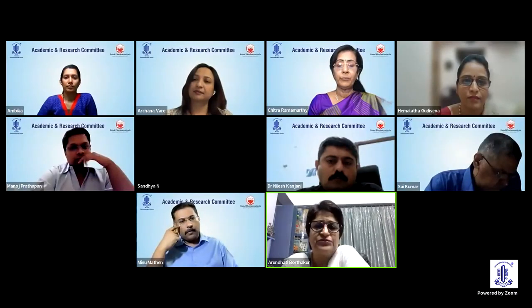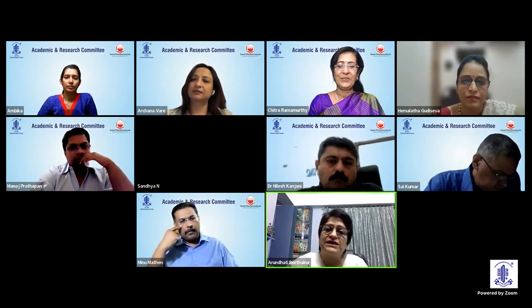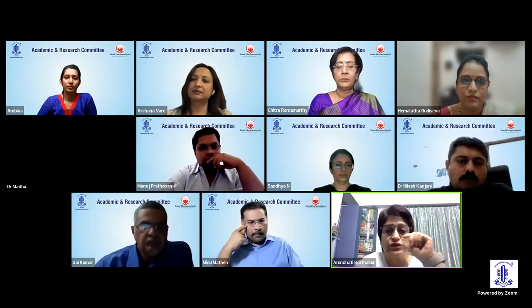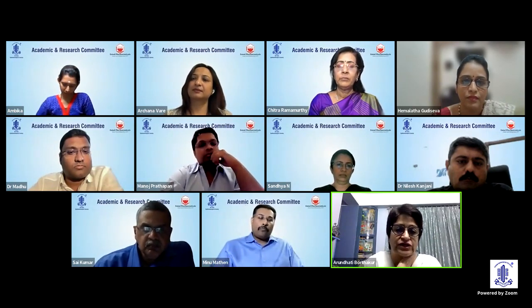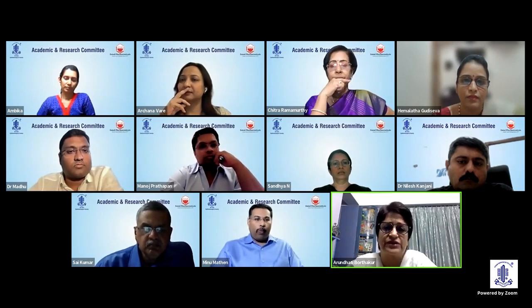I think I would have done it prior only. I think it's a beautifully done case. I should congratulate her. And again, as every speaker has said previously, I think it depends on your comfort level. Though the AC was deep, then midway, you don't want any crisis. So whatever is doable beforehand, it's better she did it. And I think I would have done the same.